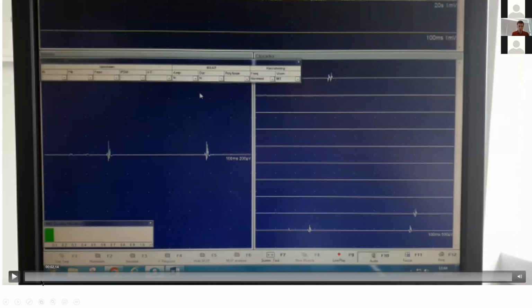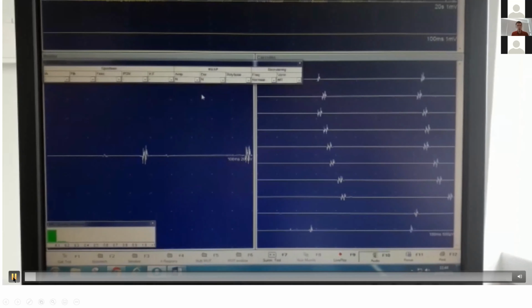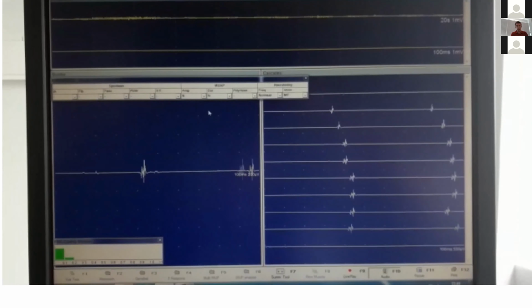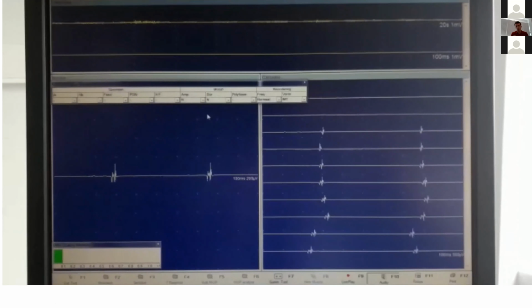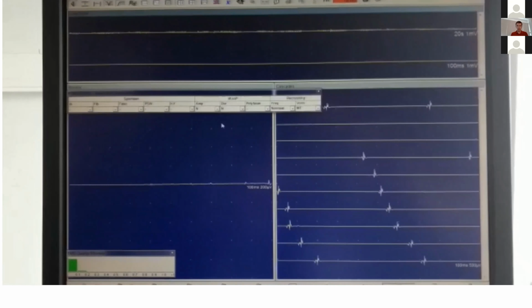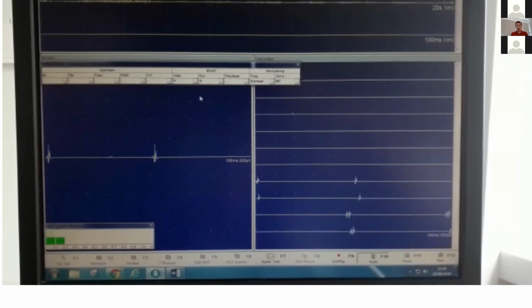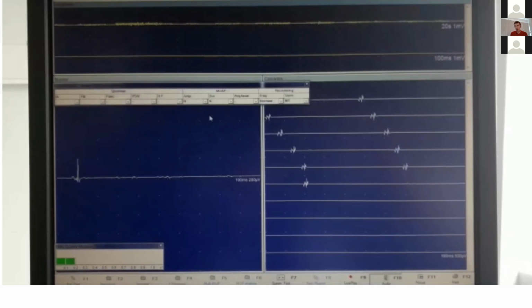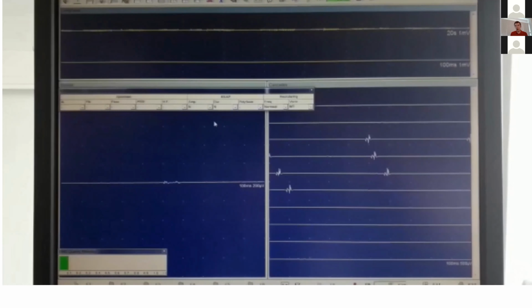Look once more. So what we see is what is inside one burst of a myokymia. So focal pathologies such as radiation, brainstem problems, mononeuropathy can give rise to this kind of myokymia. Generalized myopathic and neuropathic pathologies can show these as well.